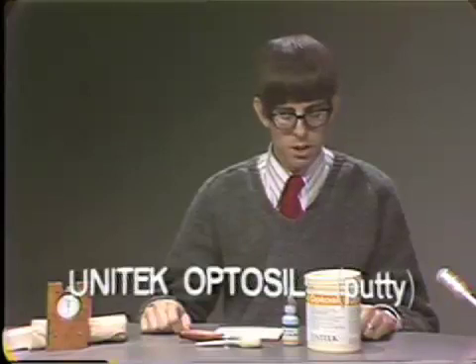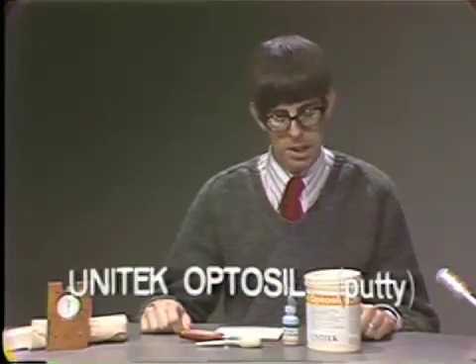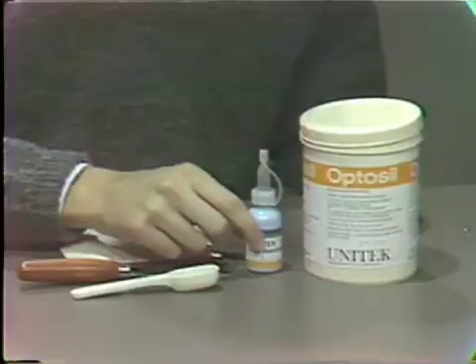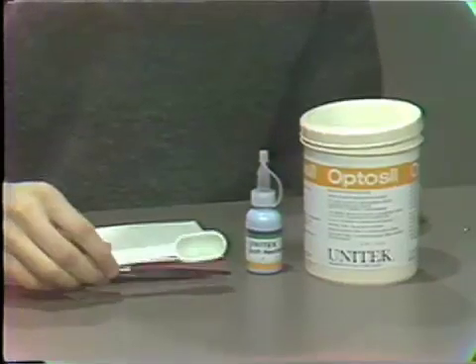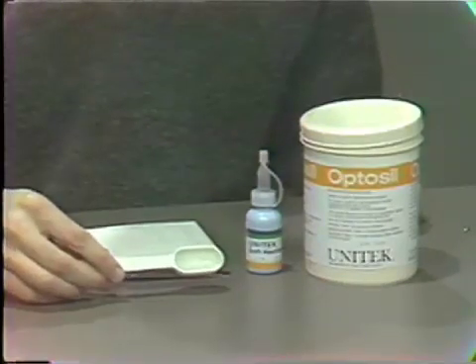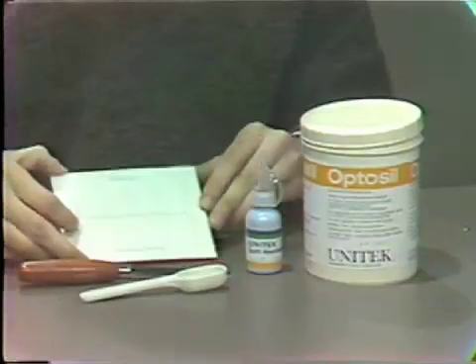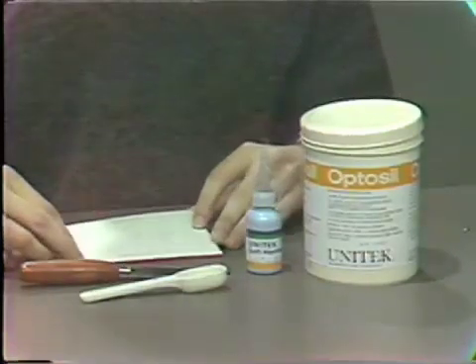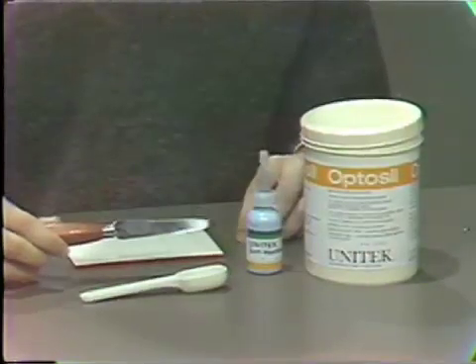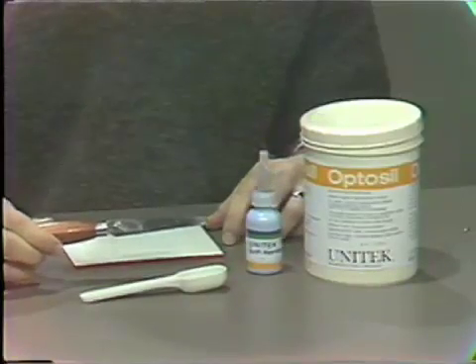Optosil is a moldable silicone impression material made by the Unitek Company. Optosil comes as a putty and a liquid catalyst system. Also provided with Optosil is a measuring cup to be used in dispensing the putty. Any paper mixing pad will do, and a stiff spatula is a necessity to mix this stiff putty-like material.